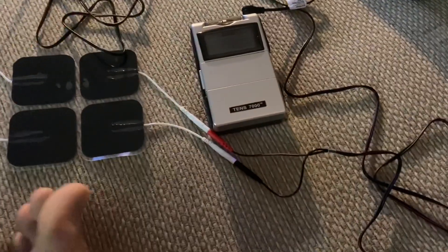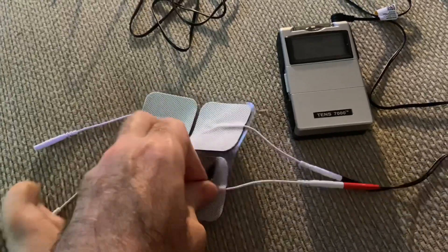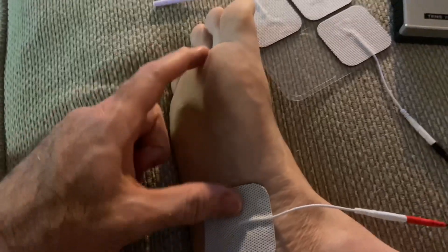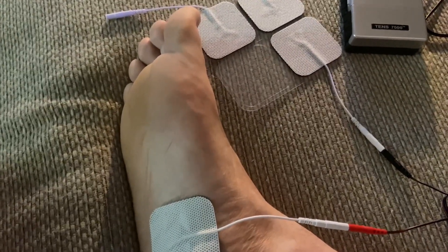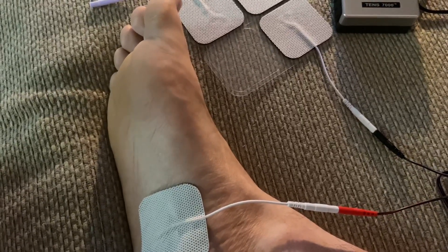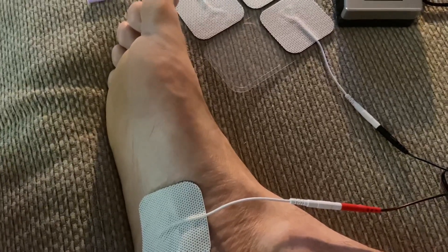I want to test this thing out, so I'm just going to do it on my foot to see what happens. If you've never used these before, they're just sticky pads you can reuse for a while and then replace. Wherever you're experiencing pain, you want to separate the pads by 2 to 6 inches. You never want to use this on your thorax — your chest or stomach area from your neck down to your waist. You can use it on your back, shoulders, arms, legs, and feet, but never on your head, eyes, or anywhere near your heart. You don't want the current running through your major organs.